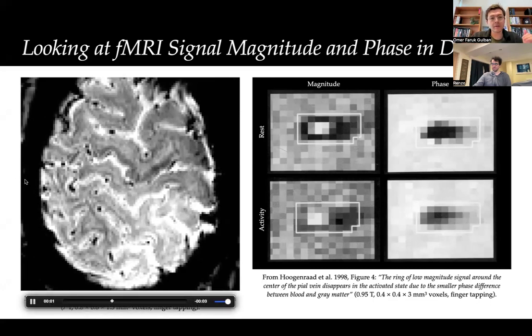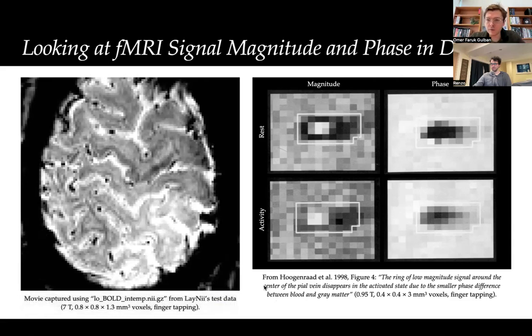And with the oxygenation level, the signal, of course, goes up, as we expect from standard fMRI, right? And you don't need to do any statistics, nothing. You see this periodic activity going up, down, up, down. So, okay, what's going on and how can we understand this whole thing? That's basically a fundamental fMRI thing.